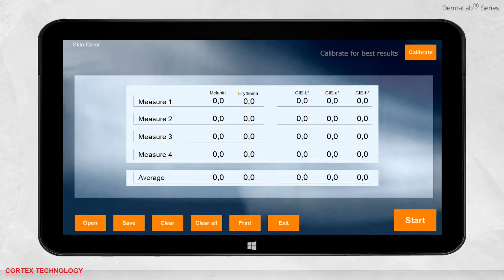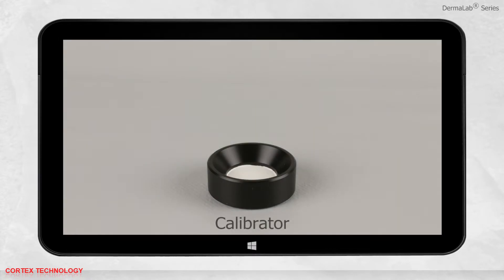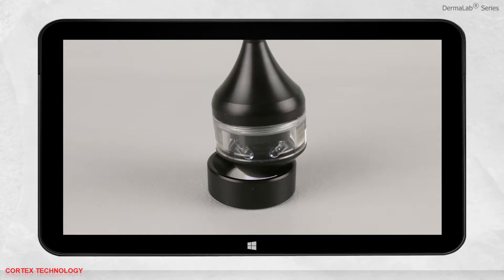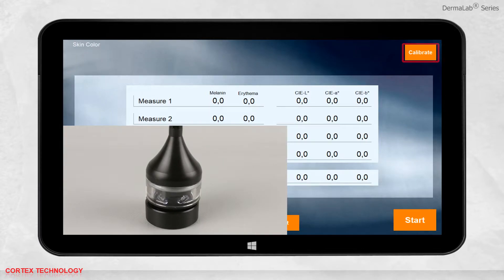Before you are ready, remember to calibrate the probe for best possible results. Place the probe in the calibrator and press calibrate. The probe will flash once and the calibration is complete.